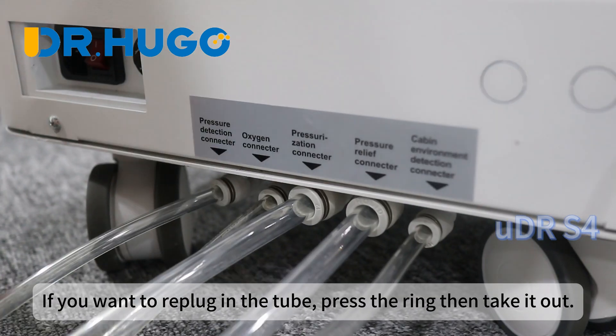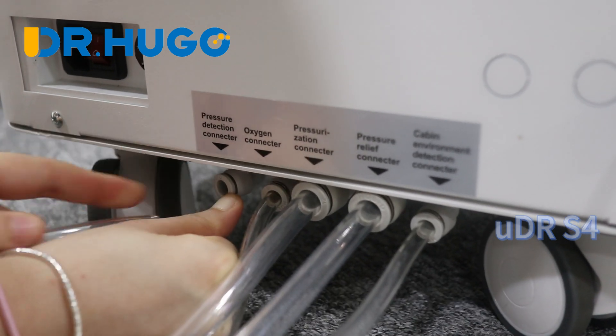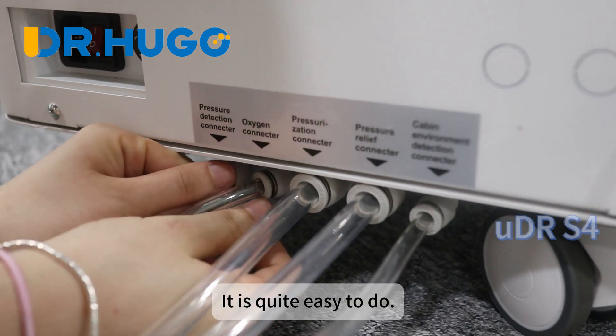If you want to re-plug in the tube, press the ring then take it out. It is quite easy to do.